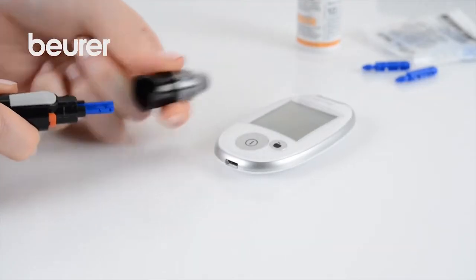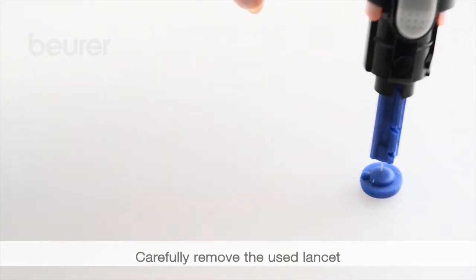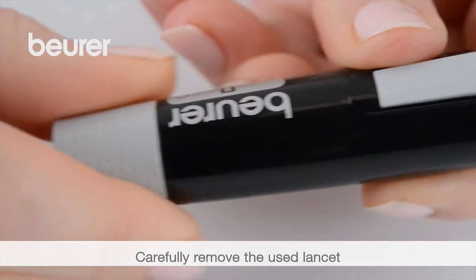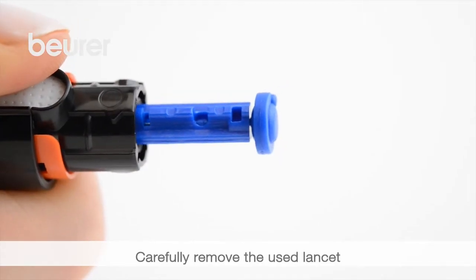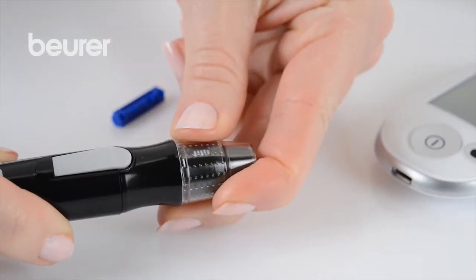Remove the cap from the lancing device. Use the tip of the needle to carefully prick the protective disc that has been removed. Press the trigger and simultaneously pull on the tensioning device — the used lancet then falls out. Place the cap back onto the lancing device.